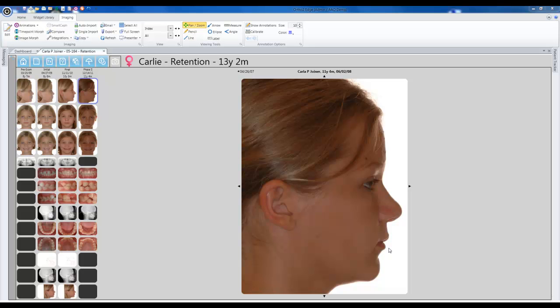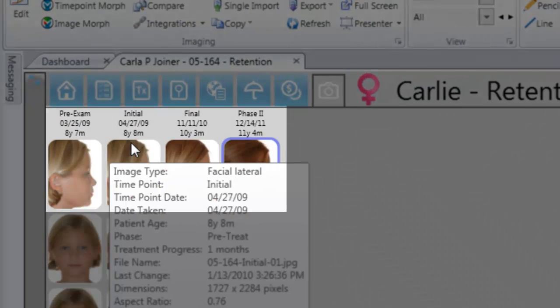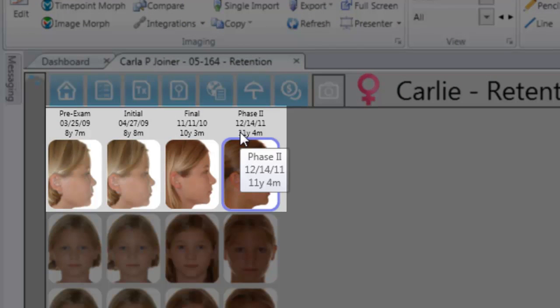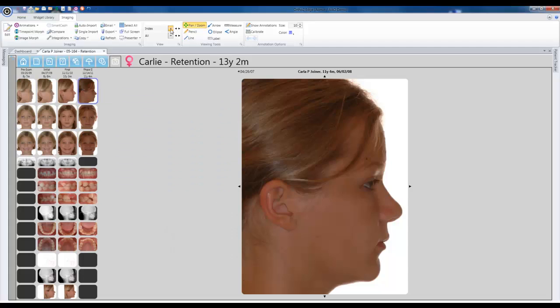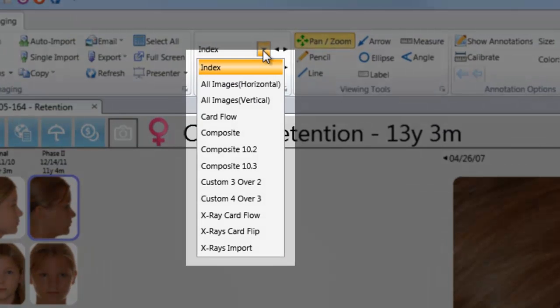Edge imaging also has presentation advantages. Note the thumbnails for each time point in one area, making it easy to navigate between images. You can also select between user-definable image layouts.